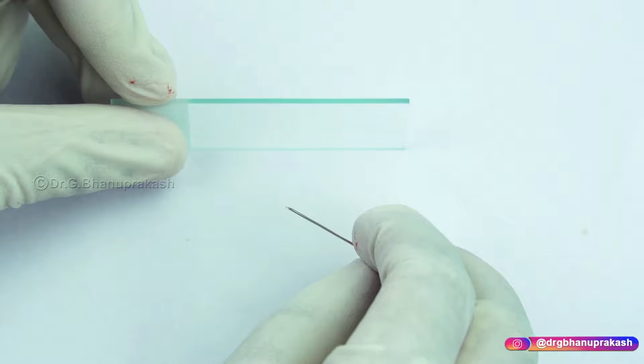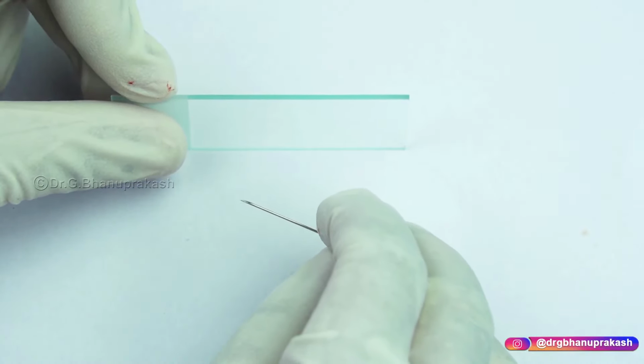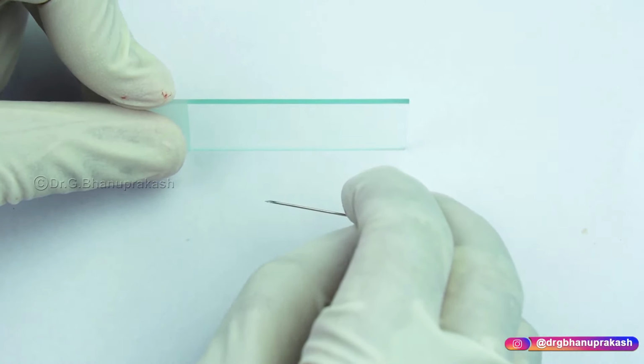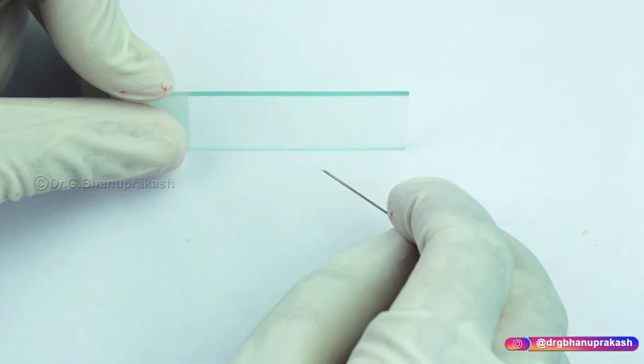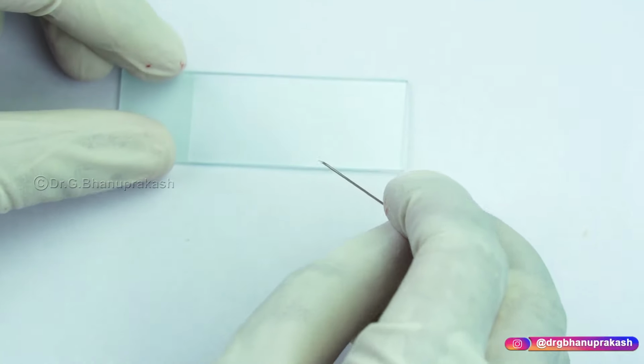And when should you start the timer? The moment you put a blood drop on the slide, you have to start the timer. And the moment you see the string coming out of that pulled blood, you have to stop the timer. And that is your clotting time. Now let us do the procedure.